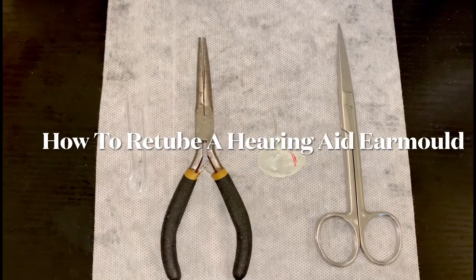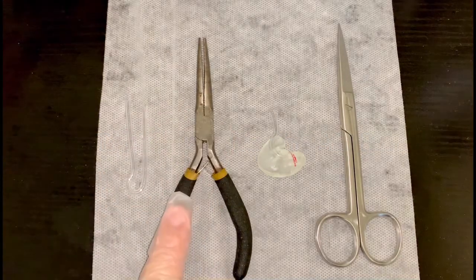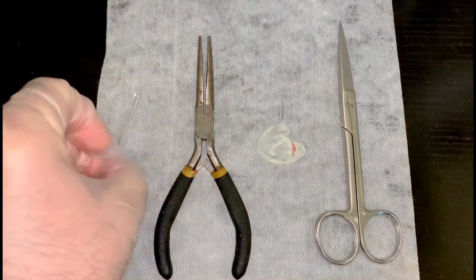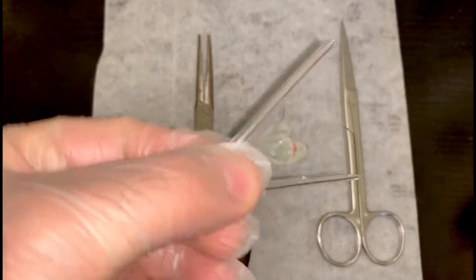Today we're going to learn how to re-tube an earmould. So we've got our pre-cut tubing, our pliers, our earmould and a pair of scissors. If you have a look at the tubing, it's already been pre-cut at a bit of an angle.